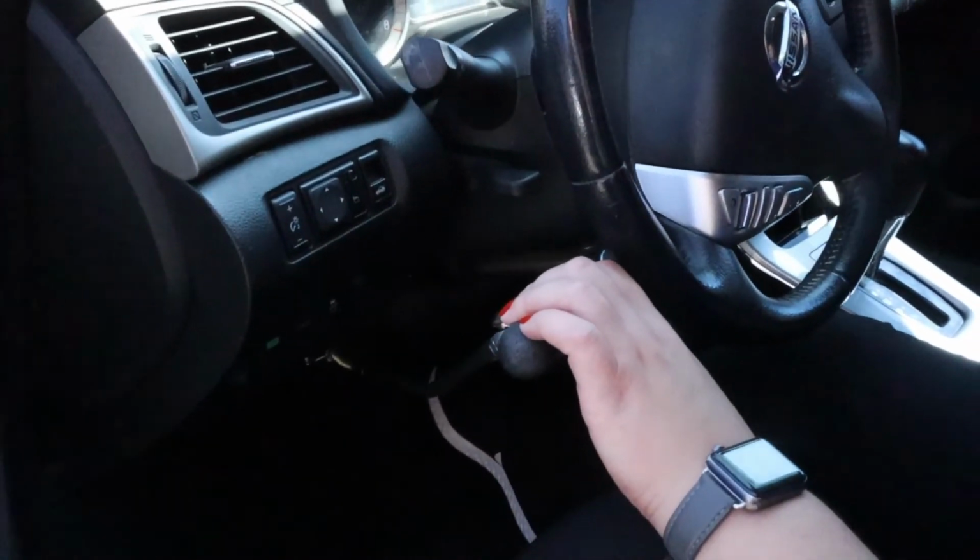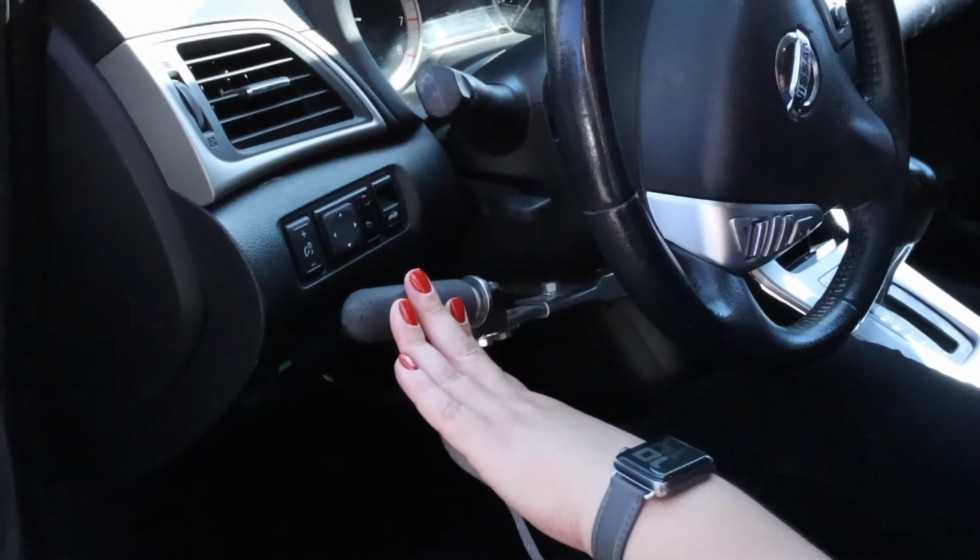When you go down, it will be your gas, and when you push in, it will be your brake. There's a lot of different styles. You can also have this one on your right-hand side if you're a righty, or there's also a twist, there's also a pull, depending on your capabilities, what you're able and not able to do. Mine, this one works perfect for me.